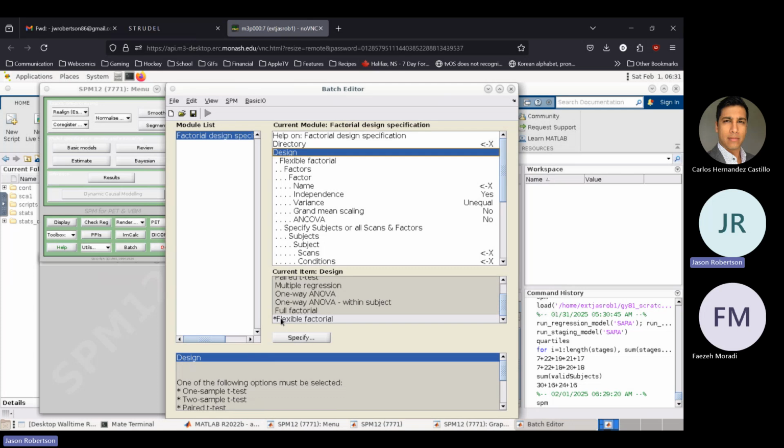Then I use dummy variables for site to separate out each site and try to regress out site effects where I can. We've already done some of that mathematically. And then age and ICV are the last two variables that get included.